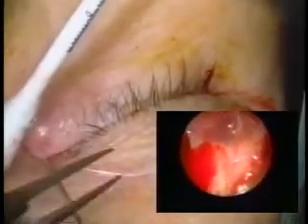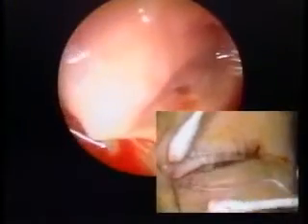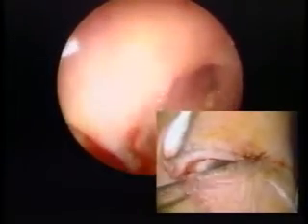The metal probe is drawn further to make a 10 mm portion of the tube flexible to follow the anatomy of the nasal lacrimal duct. The membranous nasal lacrimal duct on the temporal wall of the inferior nasal meatus is obstructed. The nunchuck tube is progressively opening the membranous nasal lacrimal duct.